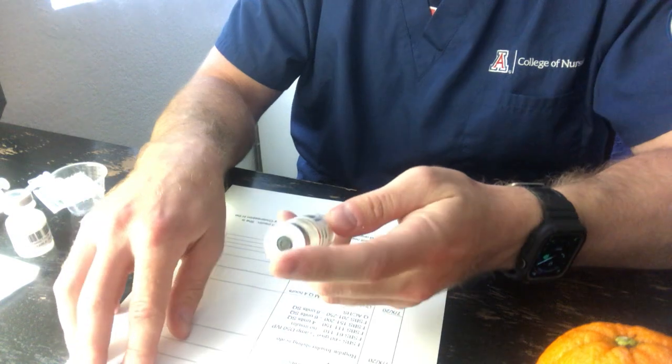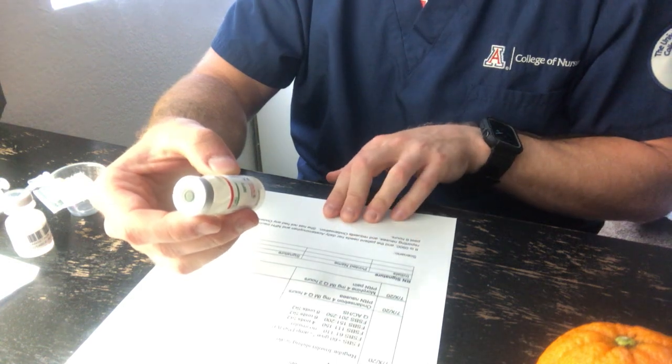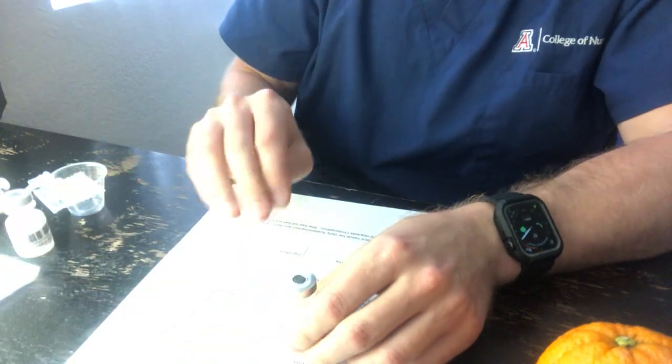I verify the patient. It's Marge Simpson. I have the right patient. It is the right time because it is given daily, and it has not been given yet. So I'm going to pull 20 units into an insulin syringe. I'm going to first clean the top of the vial with an alcohol wipe for 15 seconds. I'm going to let it dry.